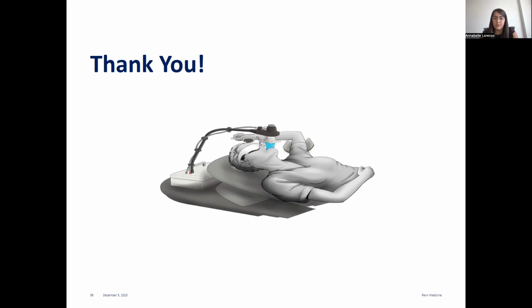All right. Do you treat the breast cases, including the supraclavicular nodal area? If so, how do you control the chin and head position to reproduce the same position if the patient needs to look at the SDX device? Is the device indexed onto the couch? We do use them for patients that we're treating their nodes.